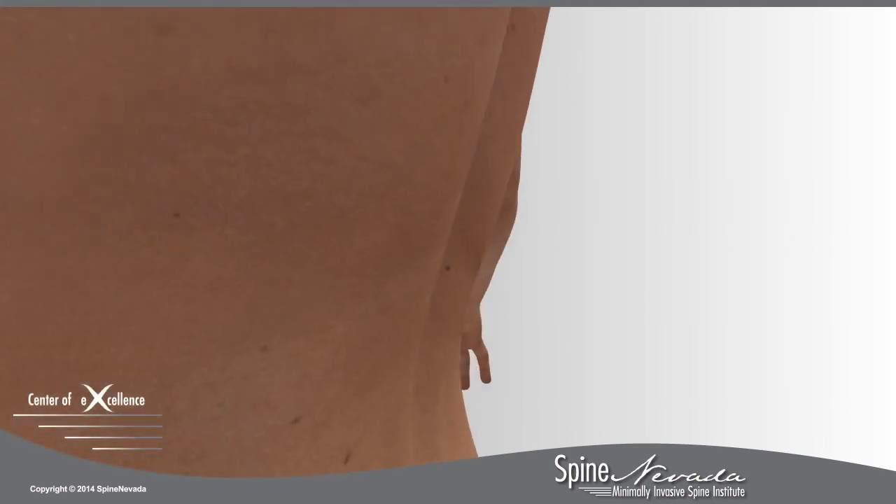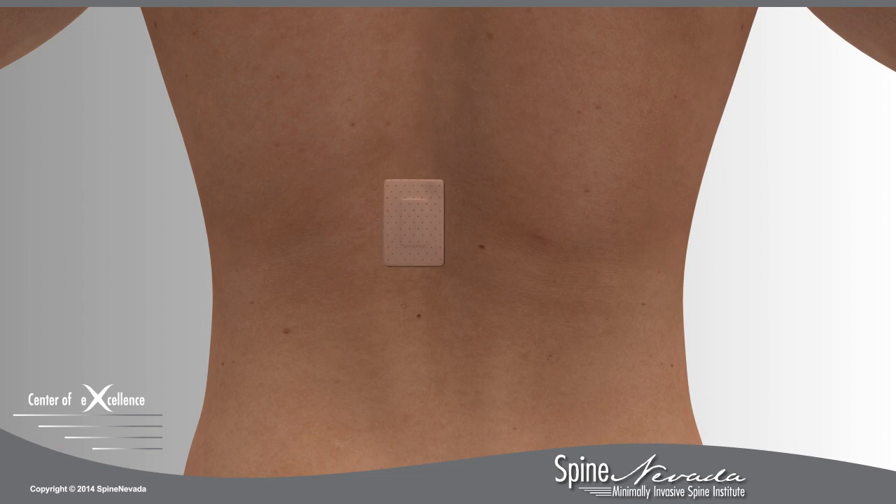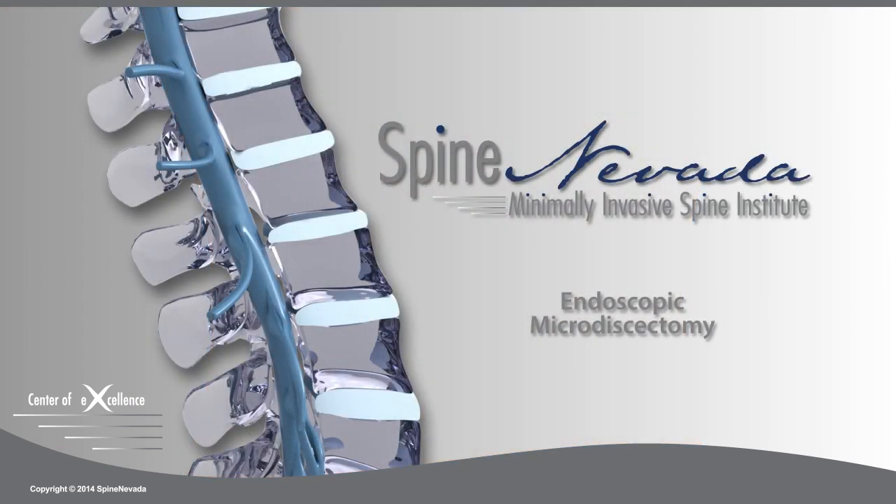The small wound is closed with absorbable sutures and a tiny dressing applied. At Spine Nevada, this procedure is performed as an outpatient procedure.